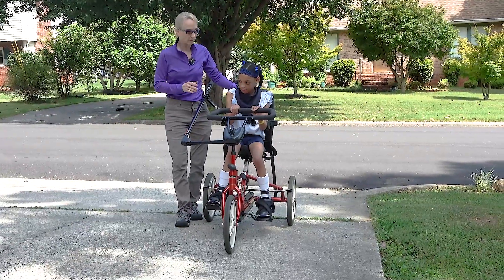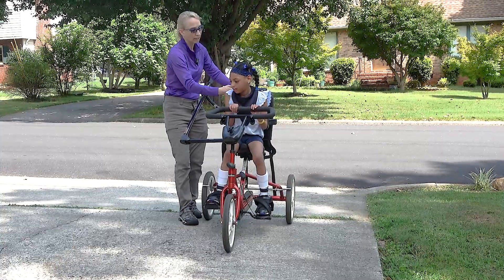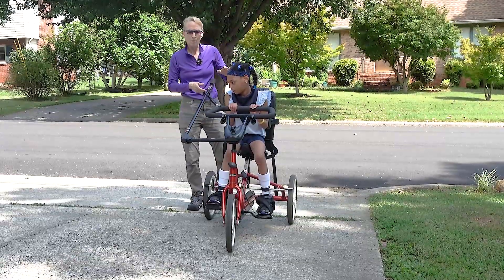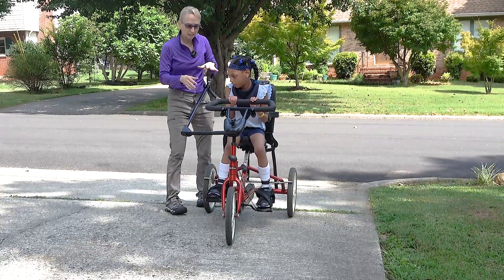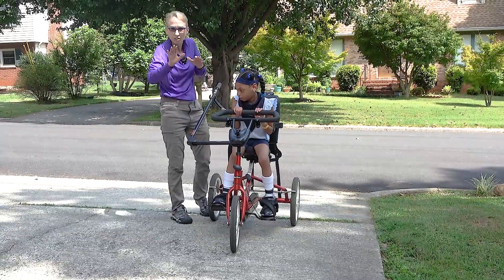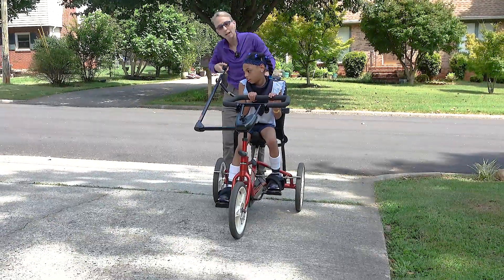I love this tricycle. It is really nice from a variety of perspectives. It allows someone to be behind and steer her. One of the things I just did was I adjusted — I like when their leg is in the fully extended position for their leg to be as straight as possible. So let's just give this a ride.